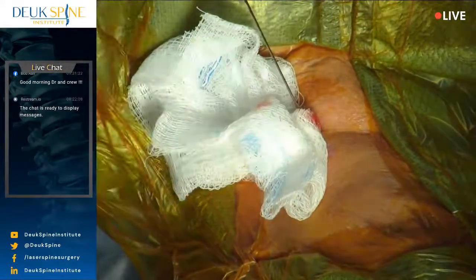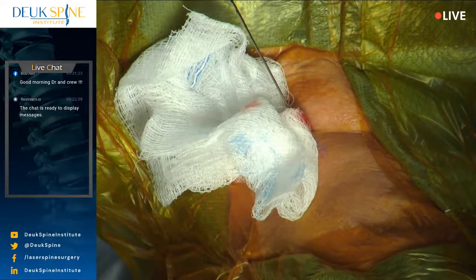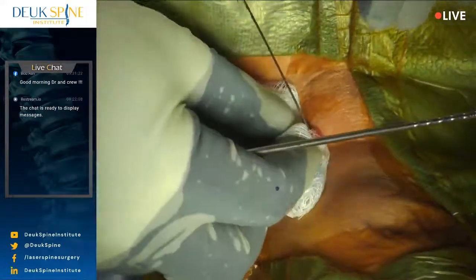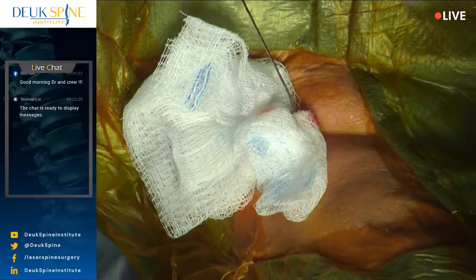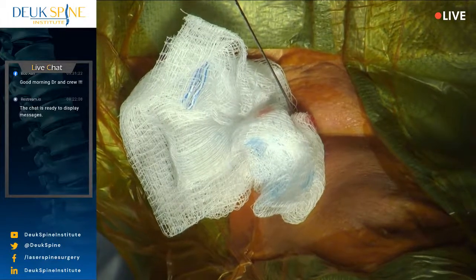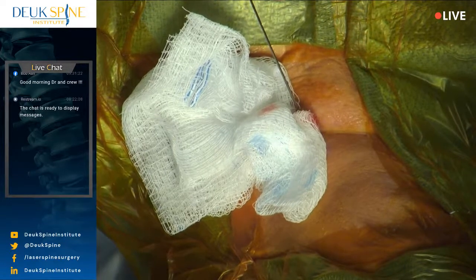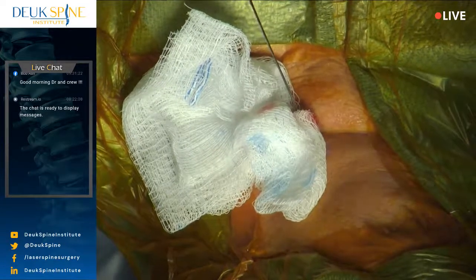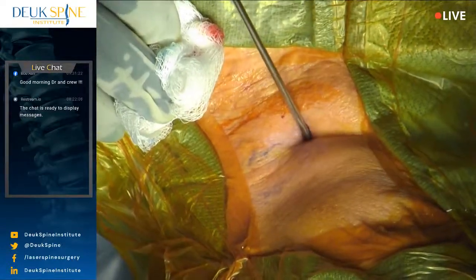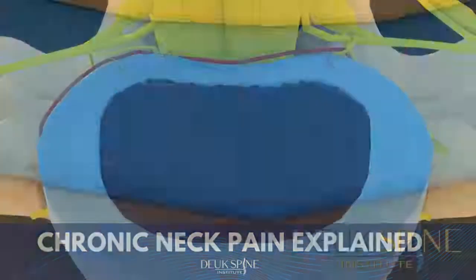That's a cervical fusion. That's what every other spine surgeon recommends in the world. And I used to do them all the time. I've done over 1,000 ACDFs. I've stopped doing them to do these laser surgeries because the laser is much better. All right, Zach, why don't you run a video for our audience to show them how a herniated disc can cause neck pain and arm symptoms. Meanwhile, we're going to place our dilator. Are you running the video? It's running now. Good.